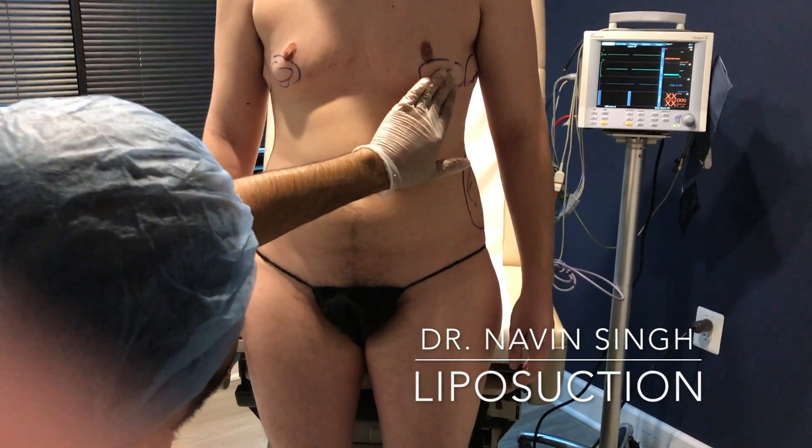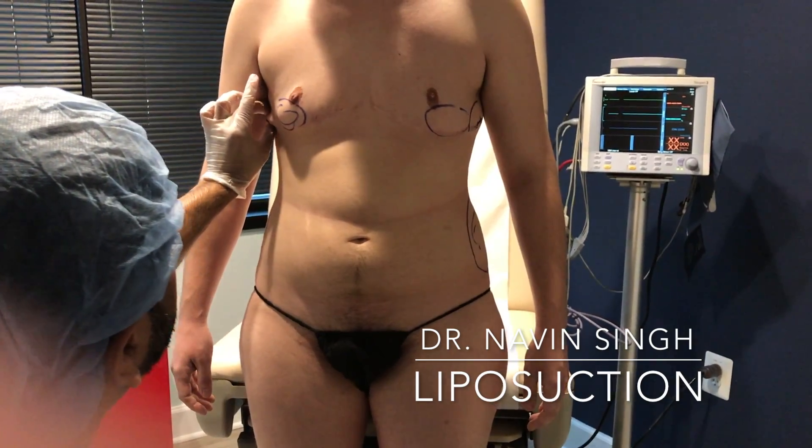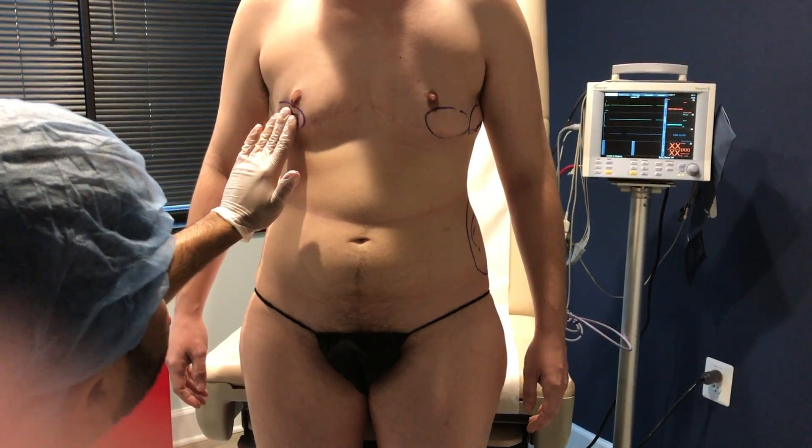This individual has already had top surgery. We're going to do a little touch-up liposuction here, touch-up towards the armpit to get this even flatter and get this volume fixed.